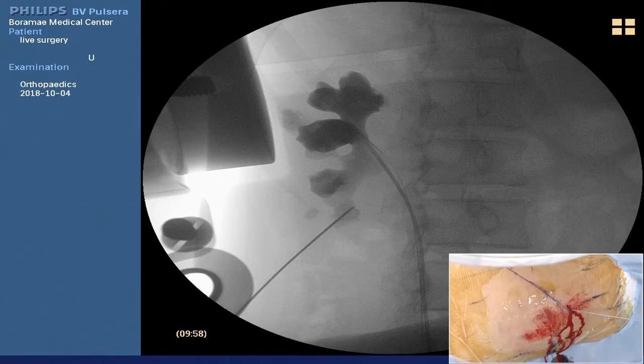So in that case, I need to use a large size, at least so that the flexible ureteroscope and nephroscope can be inserted into the kidney. So we need to consider the relative size of the percutaneous tract and the flexible nephroscope.